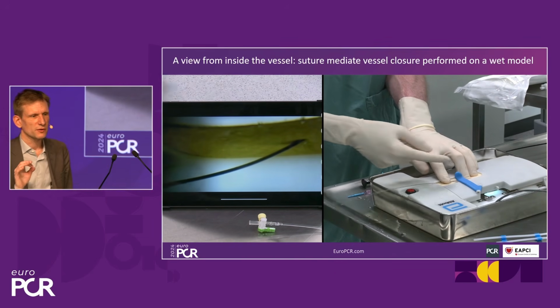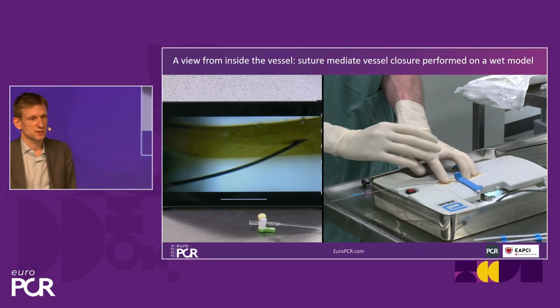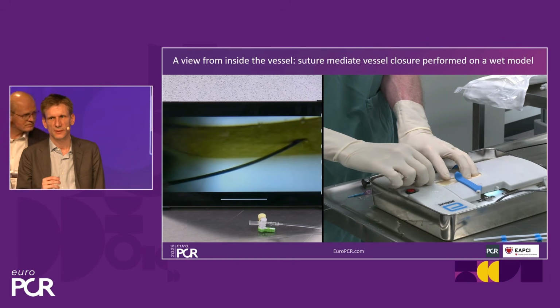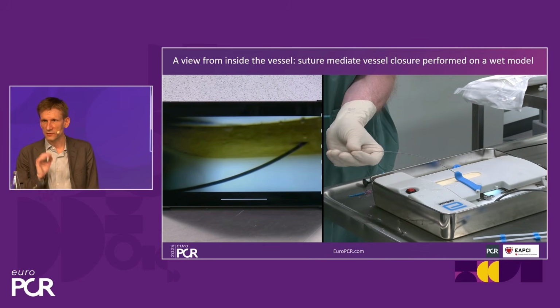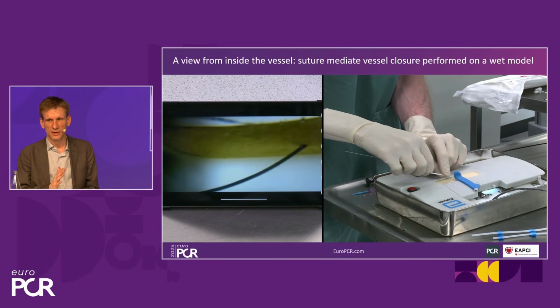What is important after you made the puncture is that you make a skin incision. Yes, don't forget to make that skin incision, because if you don't do it before you deploy your Pro-style, you may come into problems there. So it's always mandatory that you make a skin incision. After you made your puncture, don't go straight in with your Pro-style. I would not encourage that.